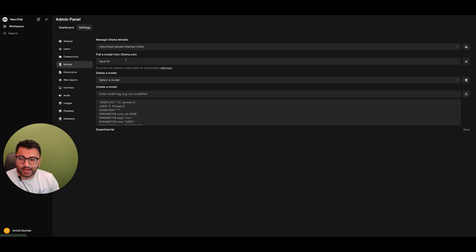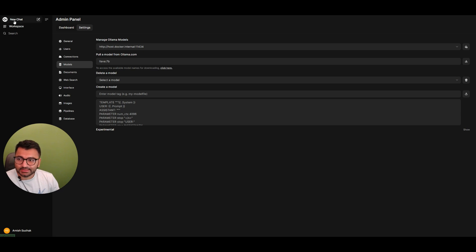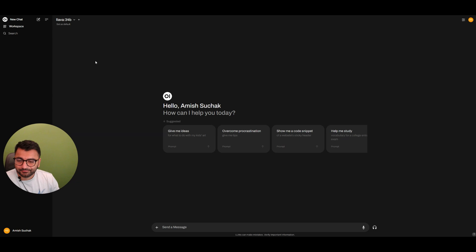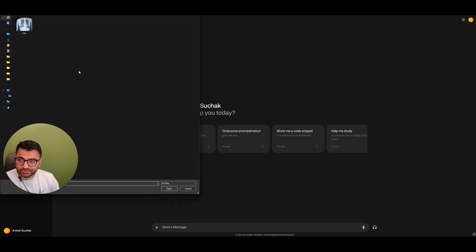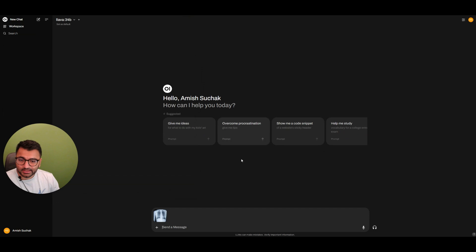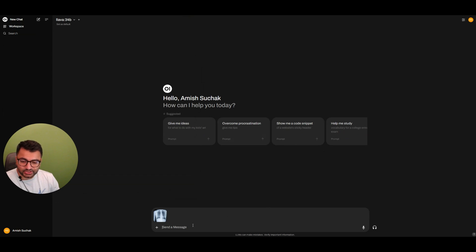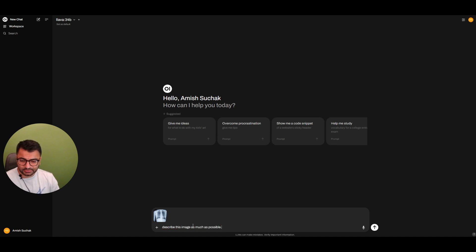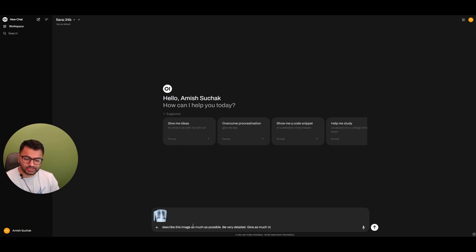Now, I've already pulled the Lava 34 billion parameter model. So what I'm going to do is to upload an image. And I'll start with an image of an x-ray. And I'm going to say, describe this image as much as possible, be very detailed, give as much information as you can.